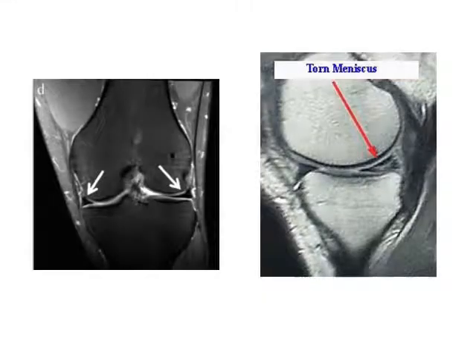All right, and then the last slide, this is the torn meniscus. Normally you're going to have this nice little black area in here. It's got some nice fluidy stuff in here, and then there's a torn one, so you see this area here with some extra fluid in there that isn't normally in there. So that's what the torn meniscus looks like on the inside.